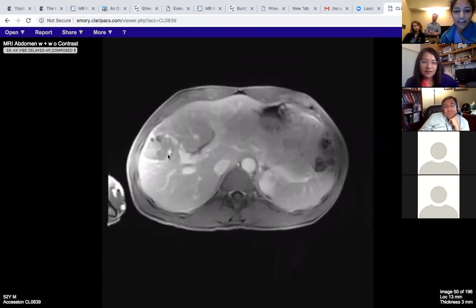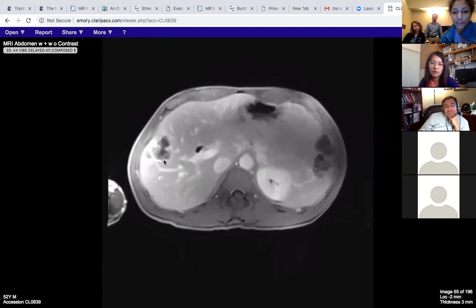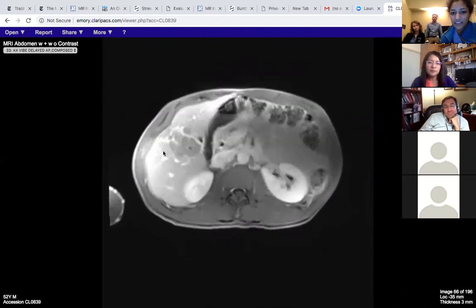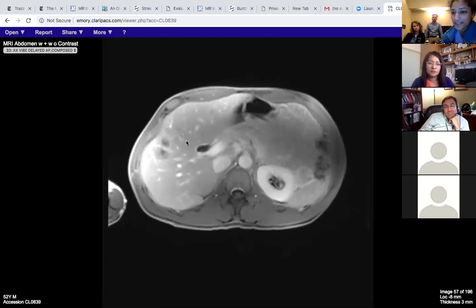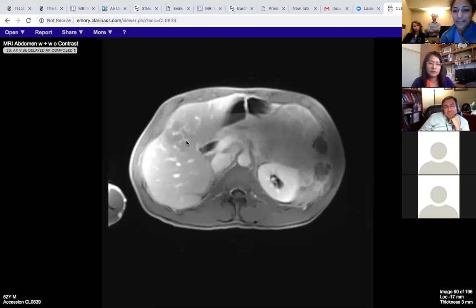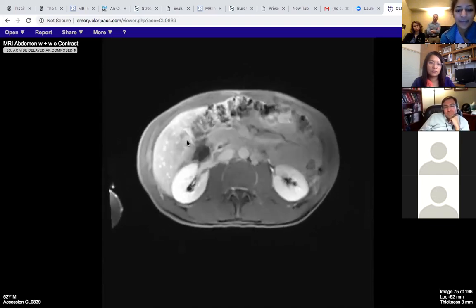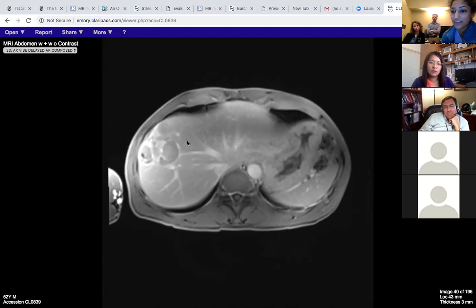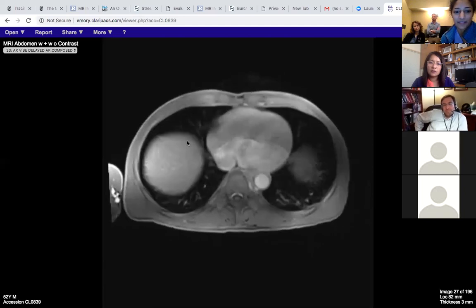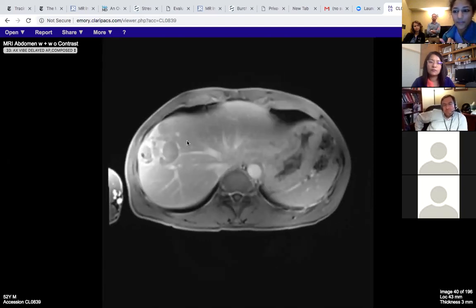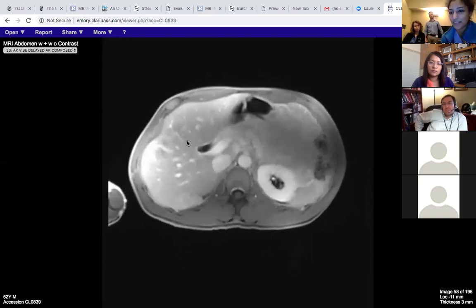A couple of things to think about: lymphoma often presents as blobby masses with lobulated borders, may have vessels going through them, but is otherwise fairly homogeneous and bland-looking. Because lymphomas are so highly cellular, they show a lot of restricted diffusion — papers show ADC values are much darker and lower than other types of masses. Lymphoma is much more common in the liver in HIV and AIDS patients, and they get a much more aggressive lymphoma. The rapid growth is not surprising given the immunosuppression and co-infection with EBV and HHV8, which are the predisposing viruses affiliated with lymphoma.